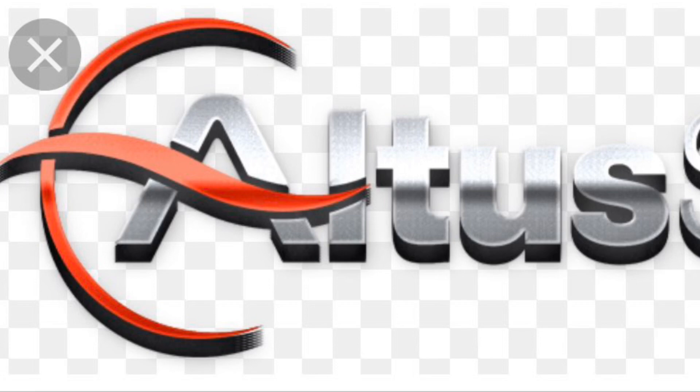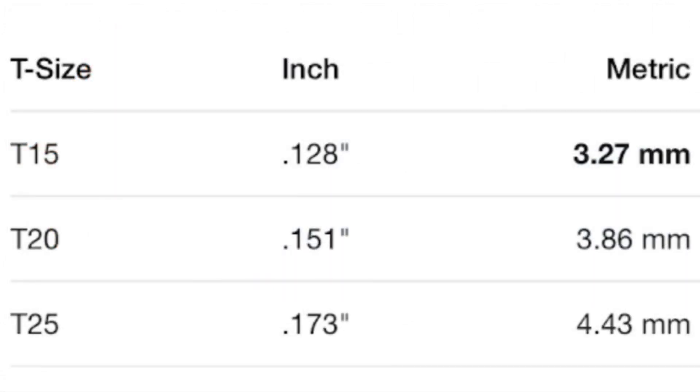You need two screwdrivers: the inner screwdriver and the outer screwdriver. This is from the manufacturer. The outer screw cap measures 4.43 millimeters, and the inner screw cap is 3.27 millimeters.